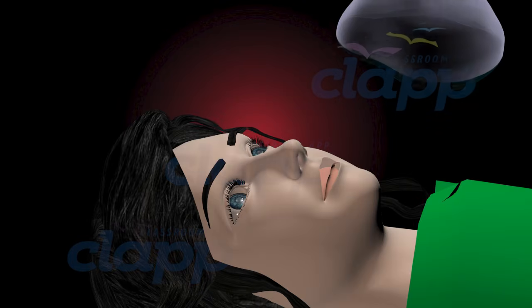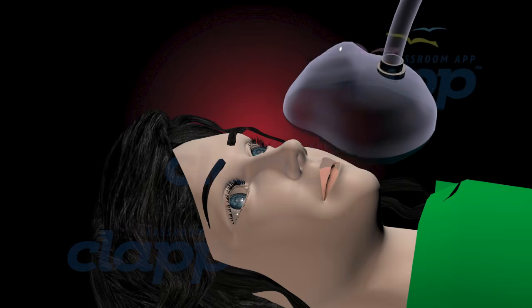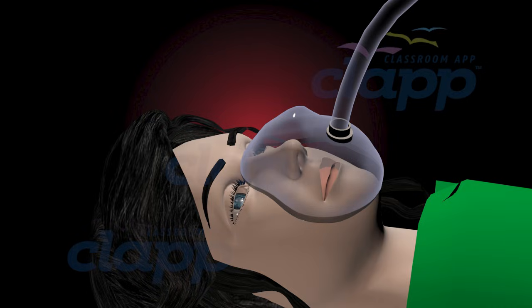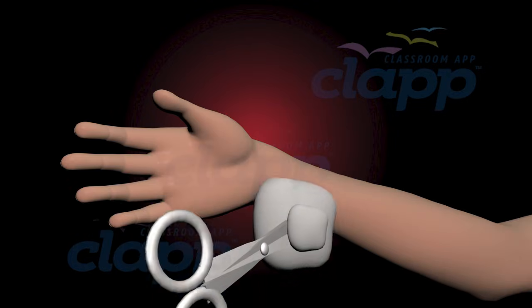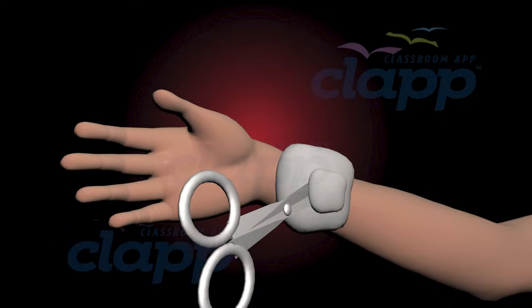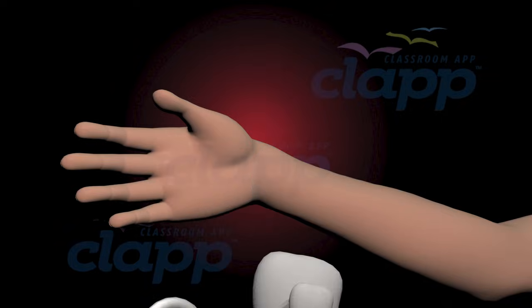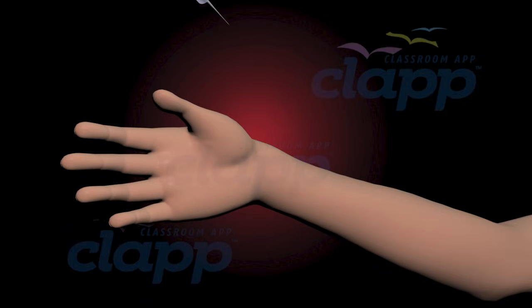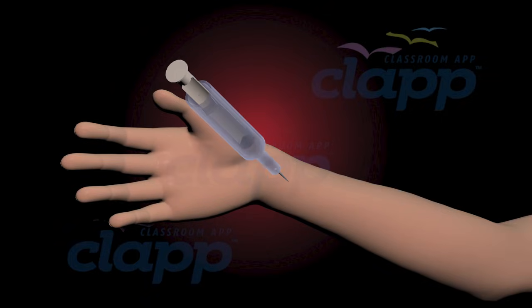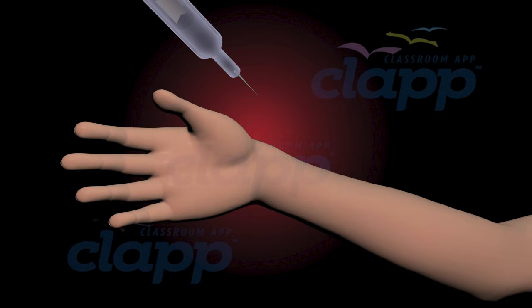Before the procedure, the patient is typically given a sedative to help them relax. The insertion site is cleaned, and the patient may also receive local anesthesia at the site where the catheter will be inserted.